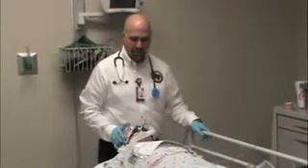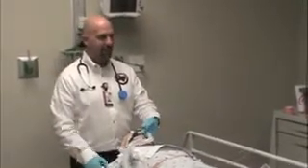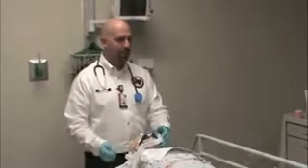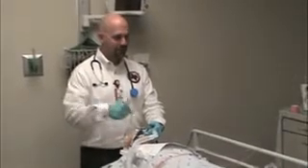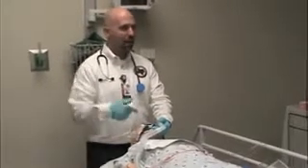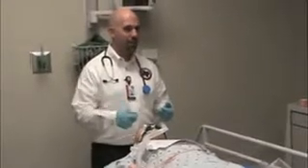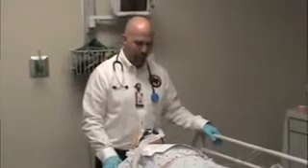O stands for obstruction. So if the patient's tube is kinked, you're going to get a pressure alarm. If they have secretions in the tube, they need to be suctioned, you're going to get a high pressure alarm. So you can use a soft suction catheter and suction the tube. If the sending hospital has an inline suction system already attached to the circuit, I would bring that with me so you don't have to break the circuit and put on sterile gloves to do tracheal suctioning. It's just a whole lot easier to use the inline circuit if that's available.